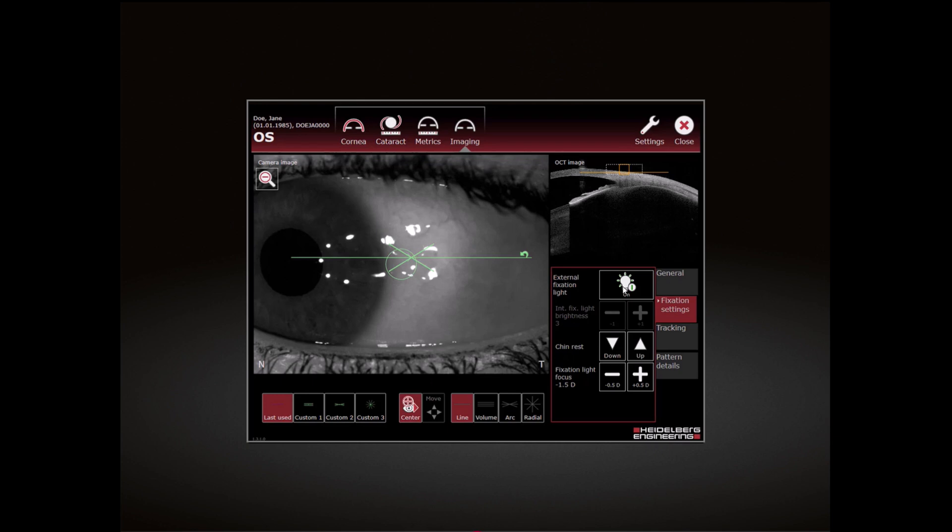Why? As you can see, the center of the eight reflection points for tracking the corneal vertex are not sharp when the patient's eye is not looking directly into the camera. Tracking is not possible in that position of the eye.